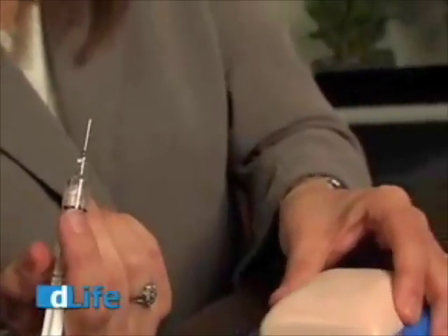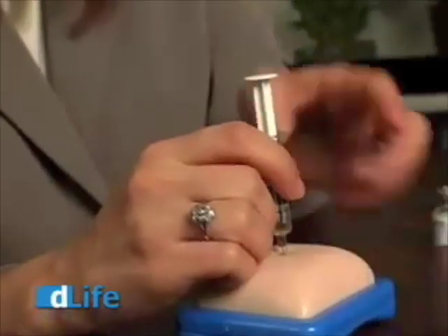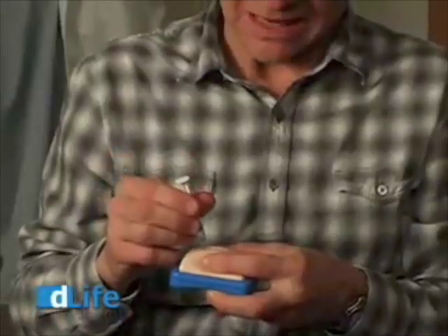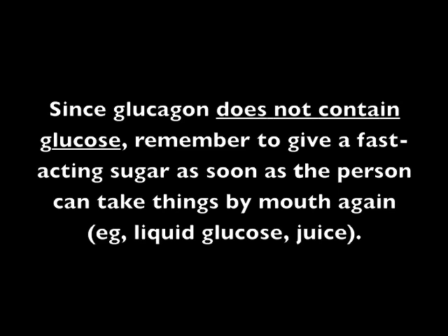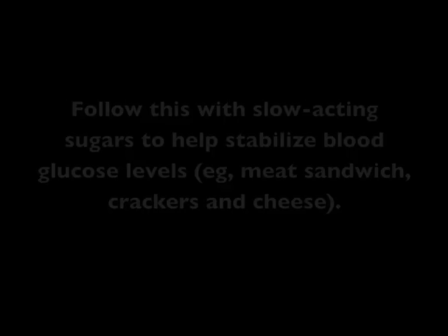Grab the skin gently like this. Insert the needle all the way down to the hub. And then inject. You'd count to three so that all of the liquid has a chance to leave the needle, and then pull out. This is approximately 10 seconds.